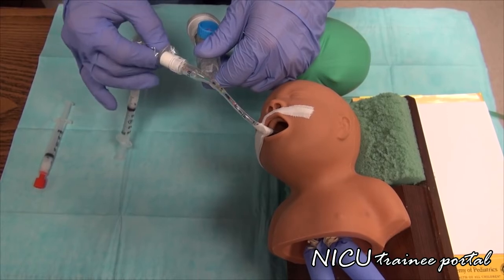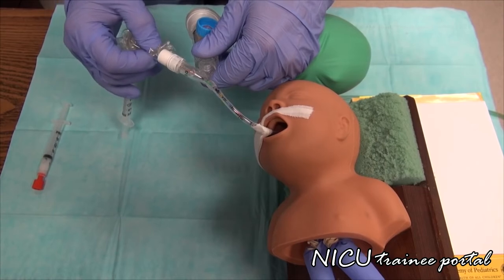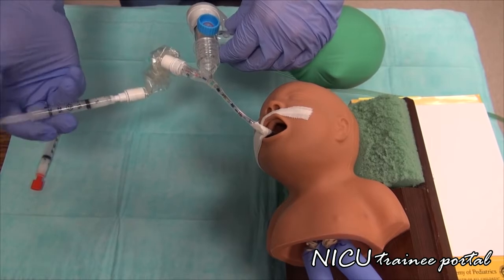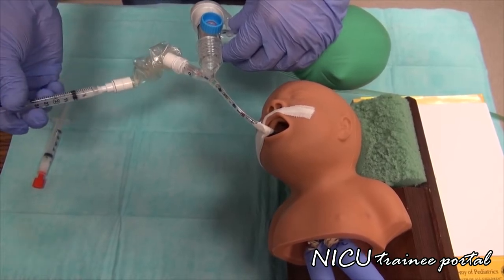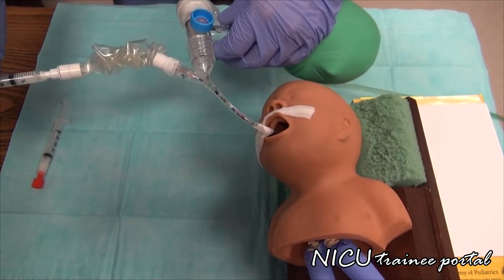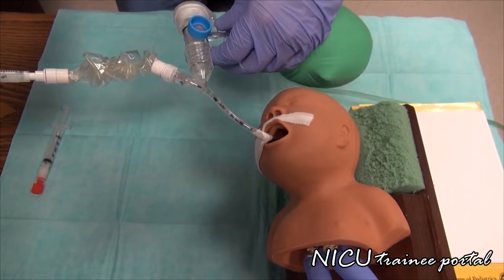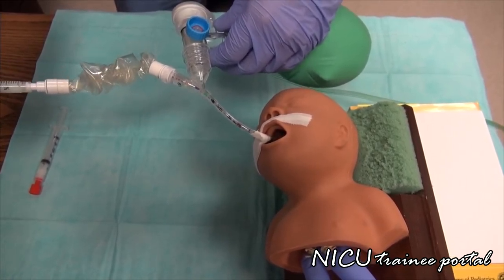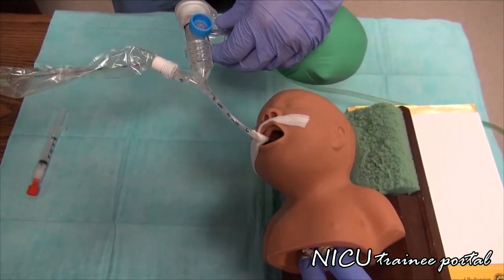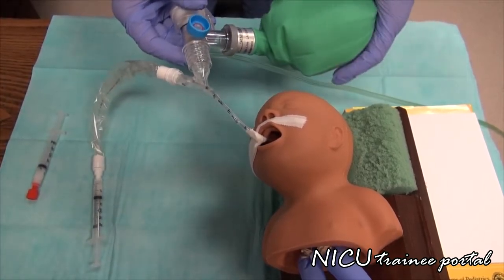Like mentioned before, we will be matching our numbers up on the catheter to the ET tube. So I will be matching up our 14 and 14 on the ET tube, advancing at about a half centimeter beyond that, and now administering the surfactant. I'll depress the syringe, administering the surfactant. You want to take around 15 to 30 seconds if possible to administer the full first aliquot.